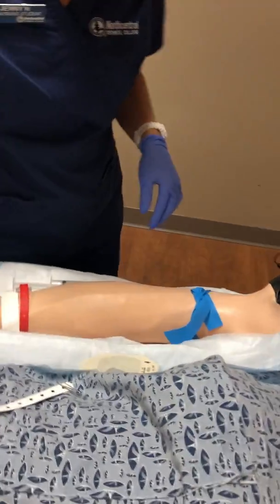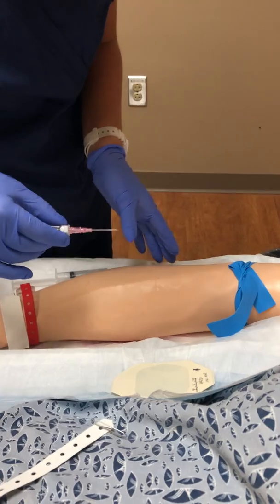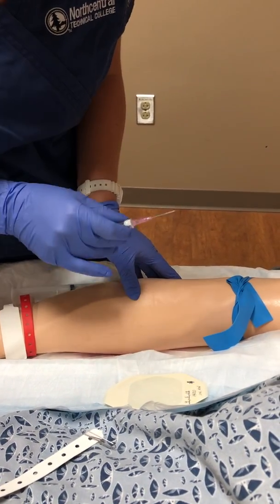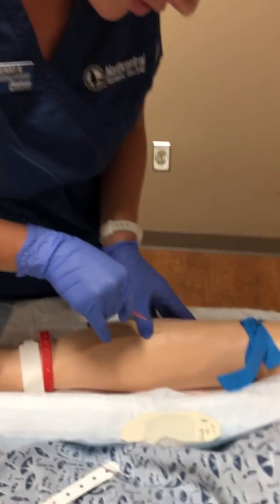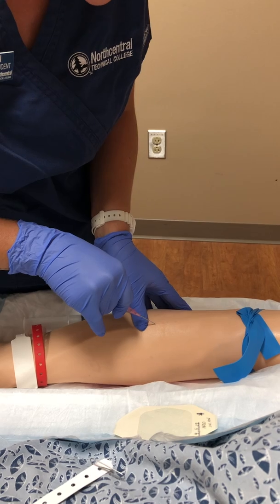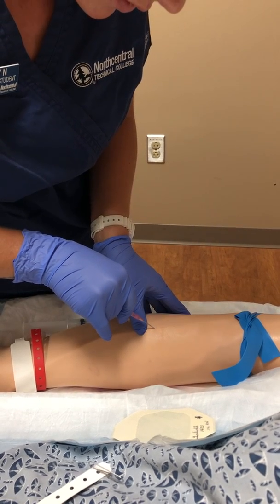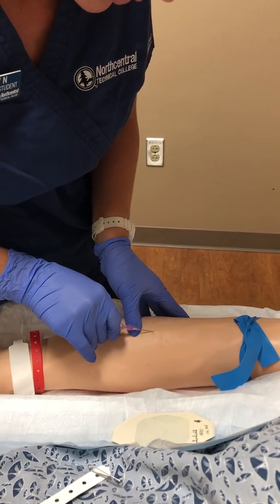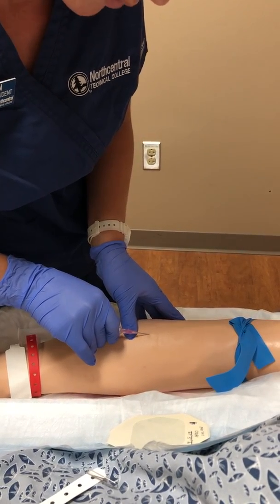All right, Mary, I'll have you take a nice deep breath. And as I'm preparing, I want to make sure that my IV needle is 15 to 30 degrees. So we'll put it here. All right, Mary, you're going to feel a little poke. Okay, there's the flash. So then I'm going to drop the catheter parallel, advance it about 1/2 centimeter.